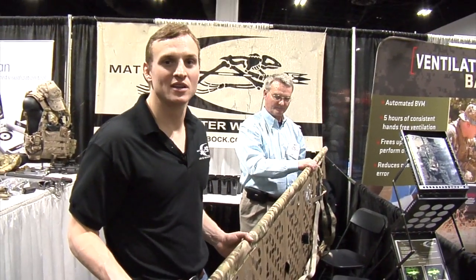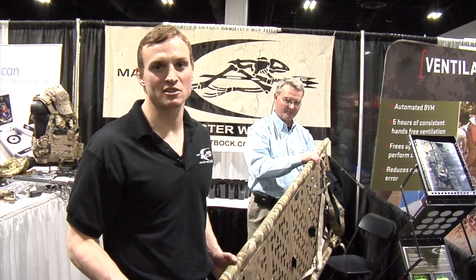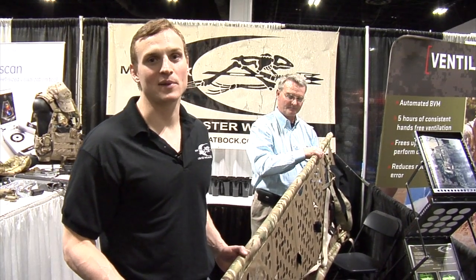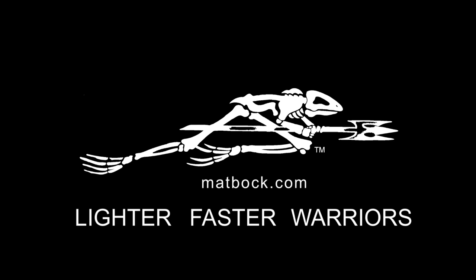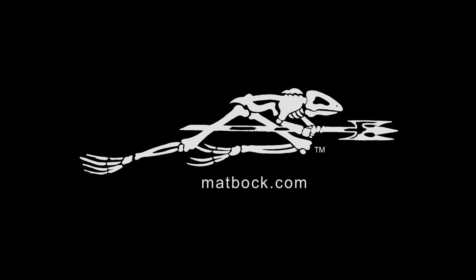Again, this is the R-Lift from MATBOCK. It's a six and a half pound fully rigid litter with a 400 pound carrying capacity. MATBOCK — Lighter. Faster. Warriors. Like us on Facebook, or check us out at matbock.com.